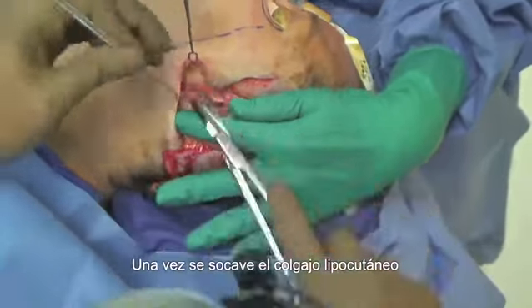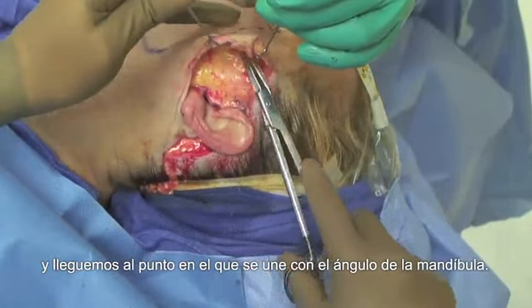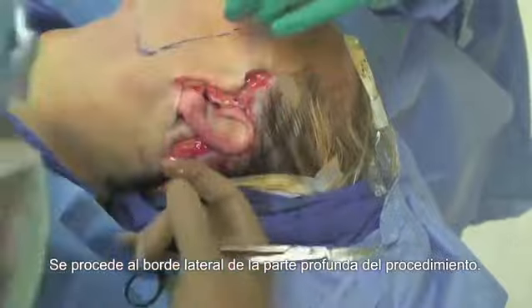Once lipocutaneous flap undermining is complete and has reached the line joining the angle of the mandible to the lateral orbital rim, attention is turned to the deep plane portion of the procedure.